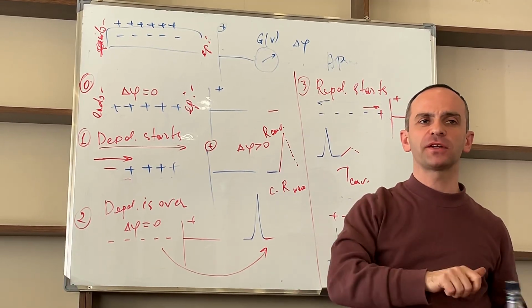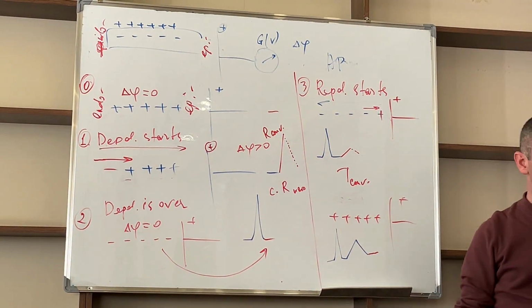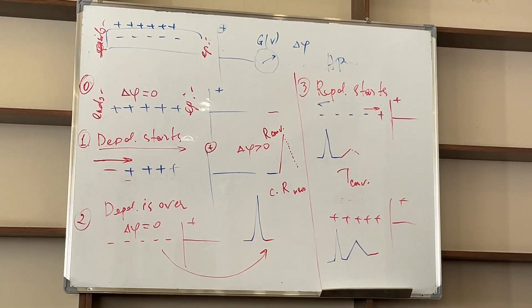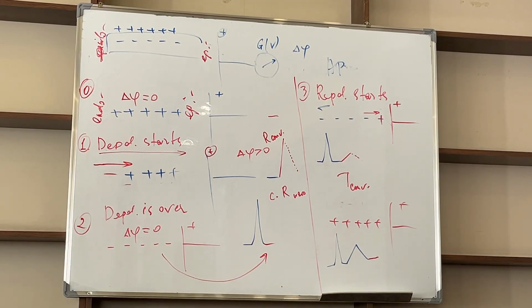Let's start from the depolarization of the atria. You may take a photo if you want.